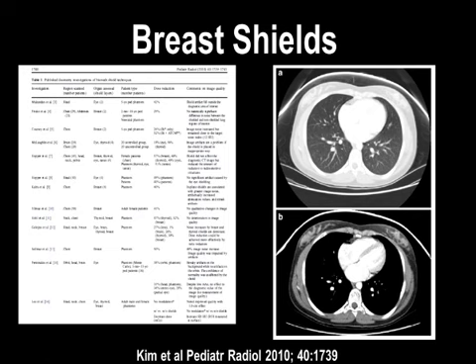And the final thing that isn't really emphasized is what does a patient understand? You put shields over her breast. Well, why are you doing this? Because we can reduce the dose of your scan somewhat. Okay, they understand that. Versus, well, what do you do to reduce the dose of my scans? Well, I have Diana Cody come through and she looks at our protocols and she turns down the tube current so it maintains a more consistent photon flux through your body, but we found that it doesn't change the attenuation. A woman's going to go, okay, I'm sorry, I asked. So from a standpoint of a patient understanding what you're doing, using these shields does have a greater impact.